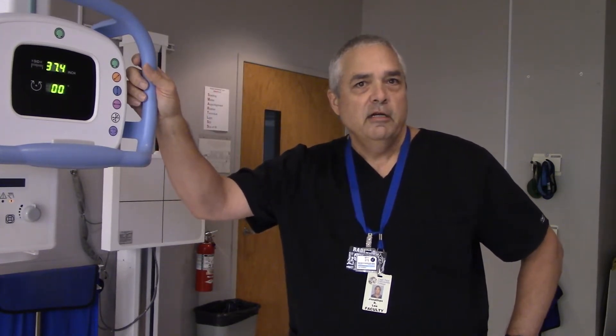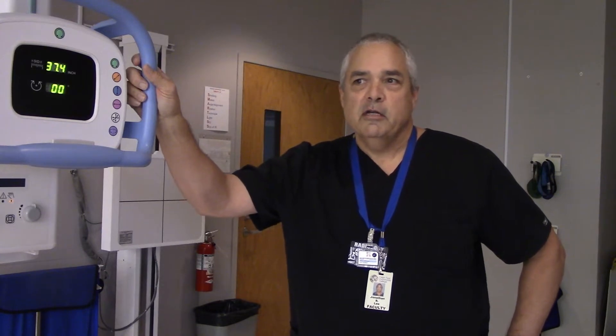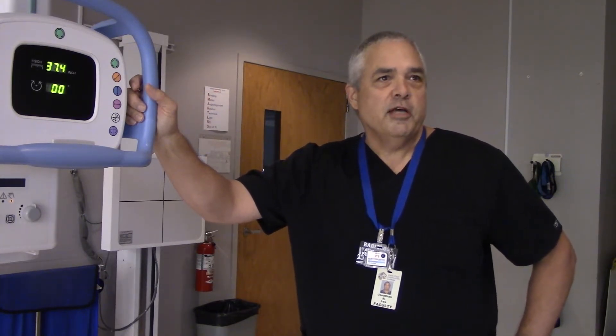So for pelvis x-rays, we get our patient on the table and then we're going to place an image receptor — 14 by 17 crosswise. Very good. Now the next thing we're going to have to do is aim our central ray at the patient.